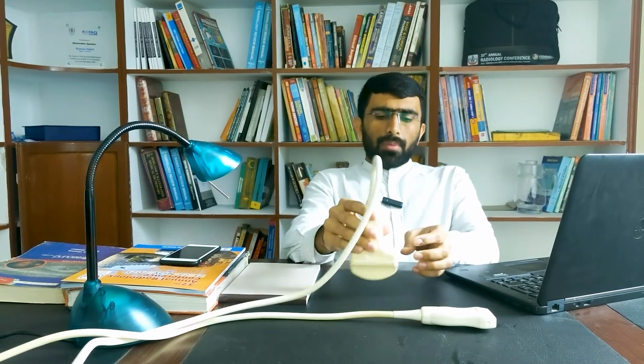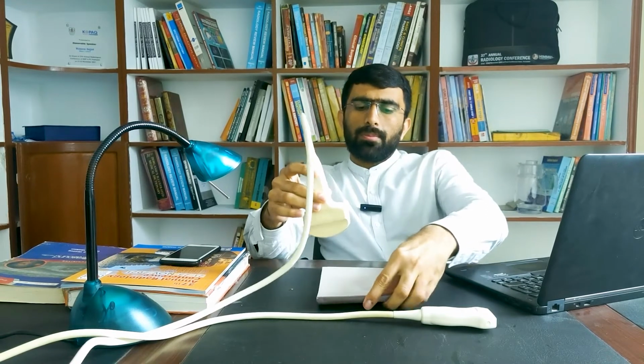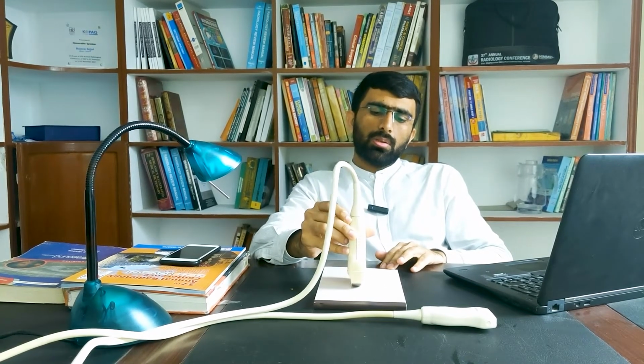After identifying the pointing end of the probe, the next very important step is how to place the probe. There are two ways to place the probe on the human surface. One is the transverse orientation of the probe, and this is the longitudinal orientation of the probe.